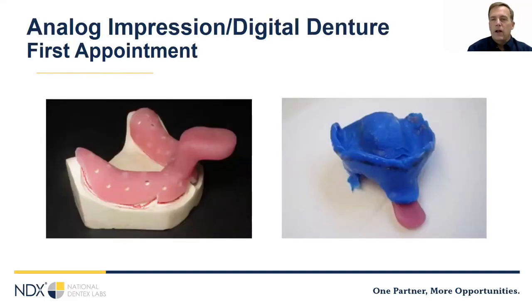Appointments when you're doing the analog digital workflow are the same as those for the analog denture we previously discussed. You can take a preliminary impression if you want and have a custom tray made, or directly take your master impression. You need to use your normal border molding procedures.